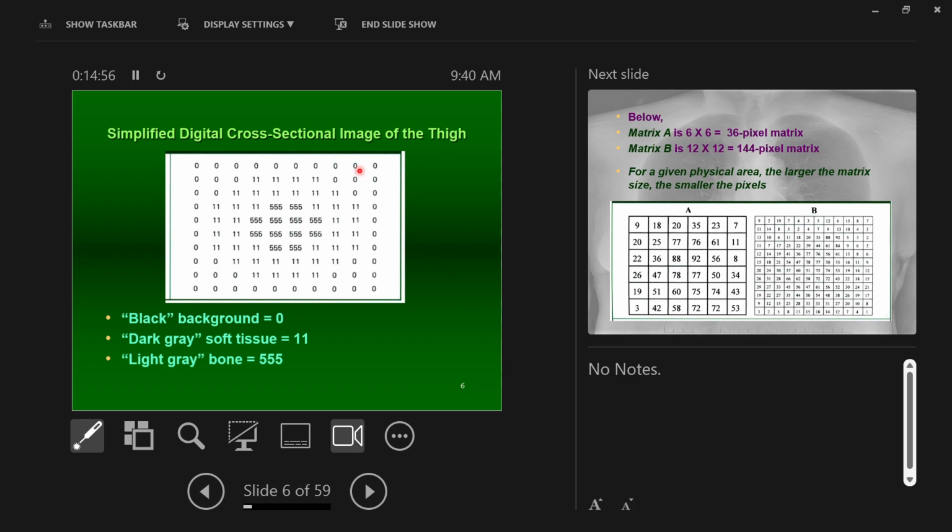There is something equivalent to film in here that is exposed, and then it's taken and processed, okay? In digital radiography, and I know some of you know this is a CR cassette, but I'm acting like it's a film cassette. In digital radiography, a similar thing is happening, right? An X-ray beam passes through a patient, and it exposes the image receptors. We call this thing the image receptor, okay?